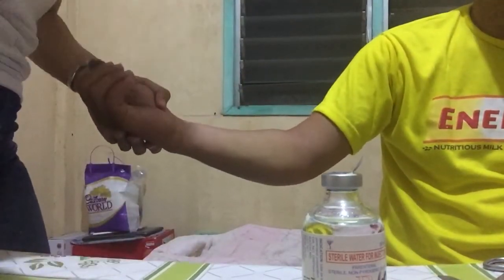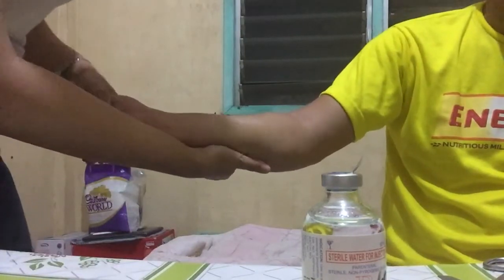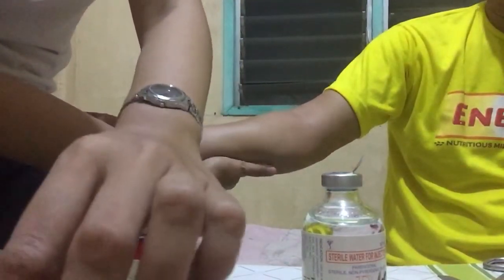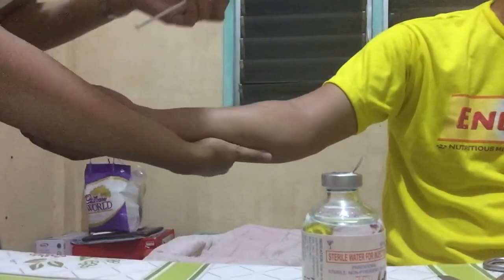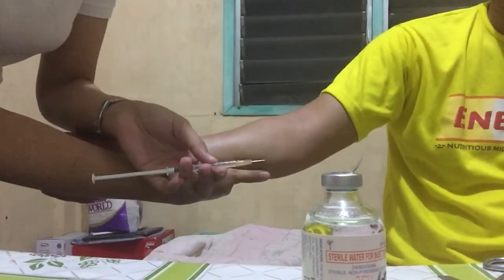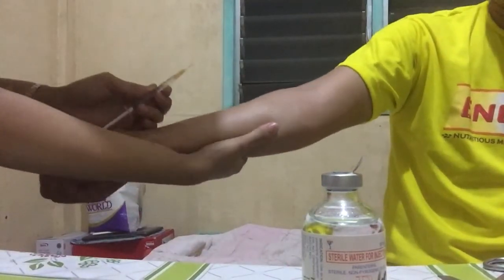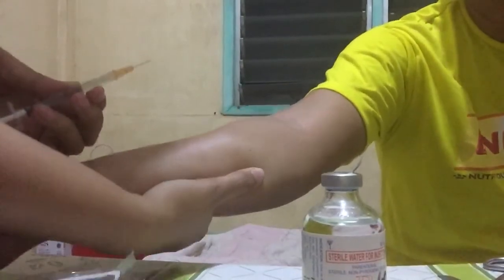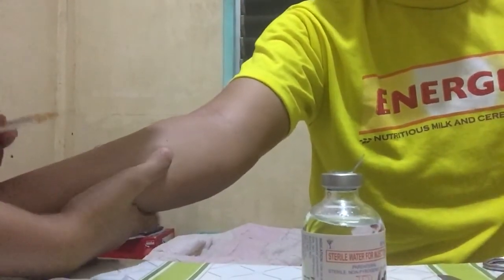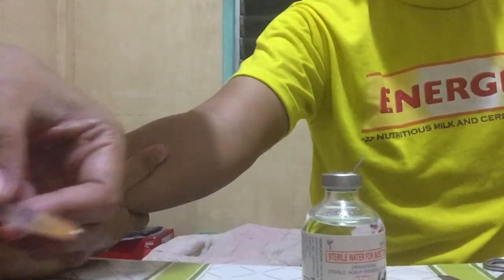Using my non-dominant hand, I'm going to stretch the skin of the patient. I will now do the intradermal injection. The intradermal injection is at about 5 to 15 degrees angle, bevel up. Be careful.